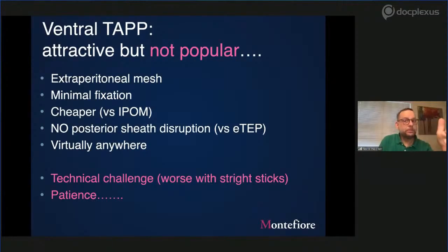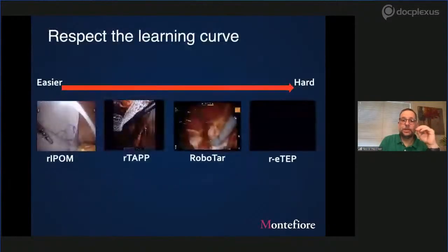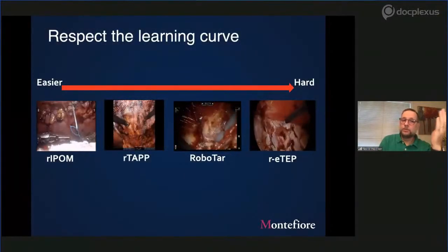Looks great on the videos, but once you are there operating on the patient, you need to be very cautious and very patient. And at the end, you see you have your holes, you need to close your holes. So it's a much easier procedure in the paper or in the presentation than in real life. So again, respect the learning curve.